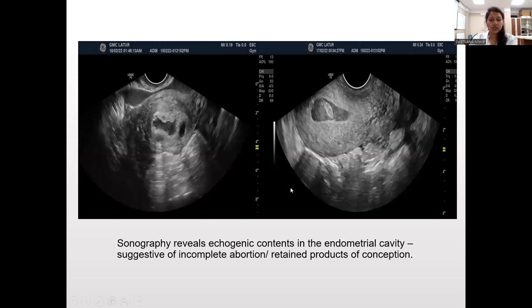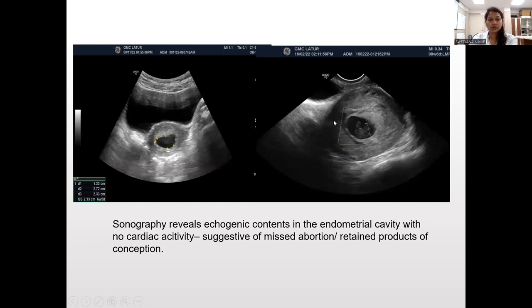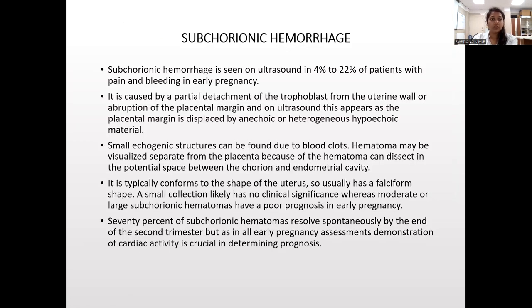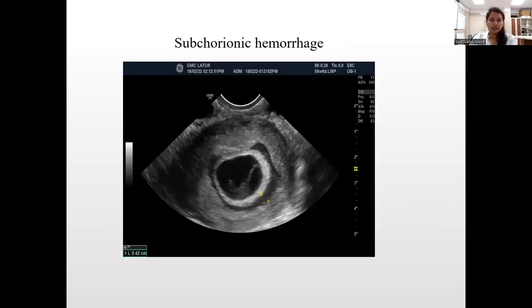This sonographic image shows echogenic contents in the endometrial cavity, suggestive of incomplete abortion or retained products of conception. This image shows echogenic contents in the endometrial cavity with no cardiac activity, suggestive of missed abortion or retained products of conception. Subchorionic hemorrhage is a partial detachment of trophoblast from the uterine wall, seen on ultrasound as a crescent-shaped anechoic or heterogeneous hypoechoic material at the placental margin; small echogenic structures can be found due to clots. It usually resolves, as seen in this image.